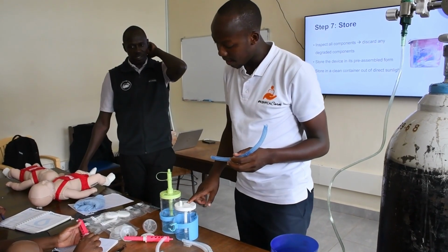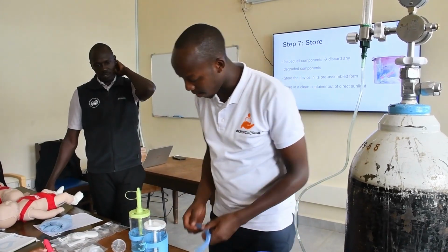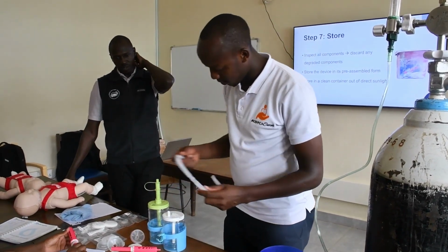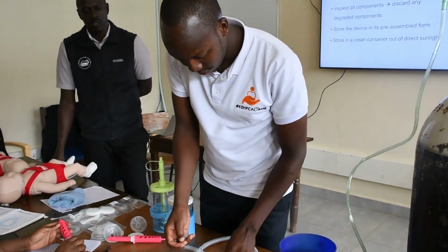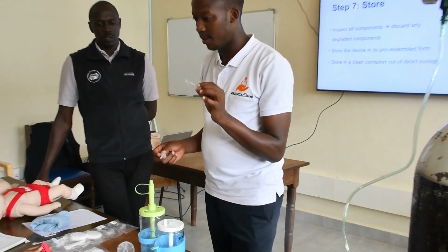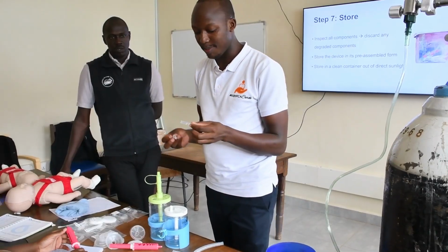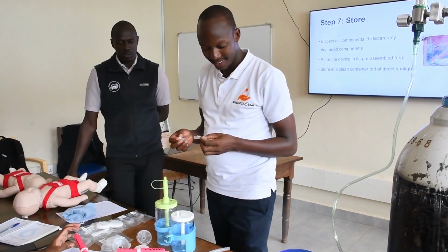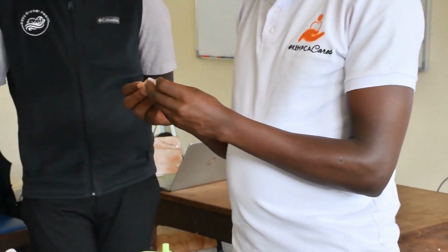So this is the inlet. Let's go with this for the patient. We choose this based on the patient. Let's fix this first.